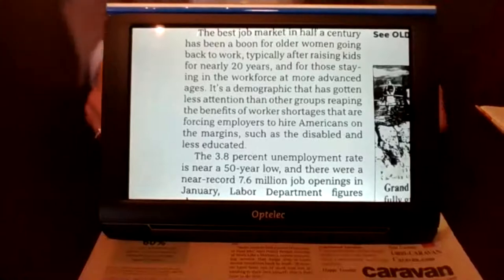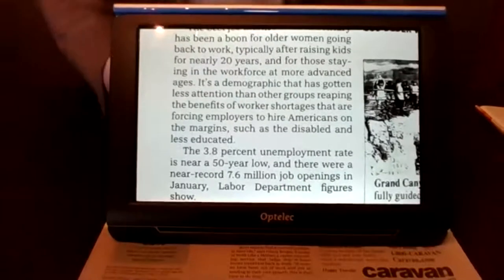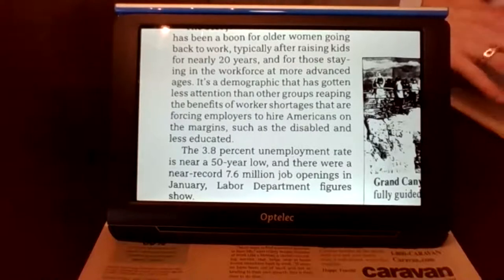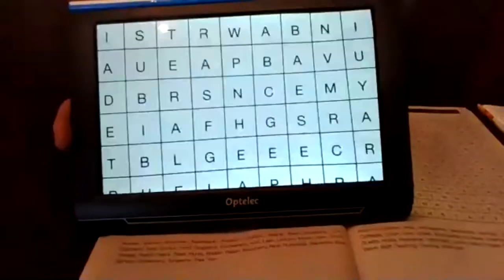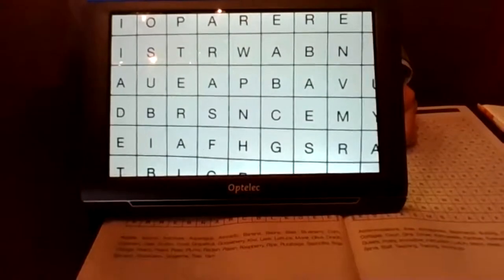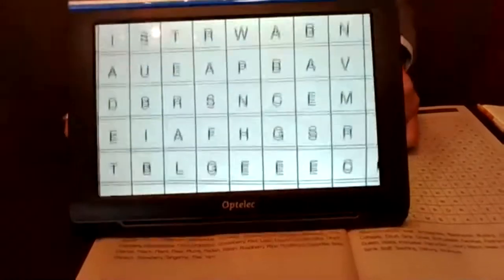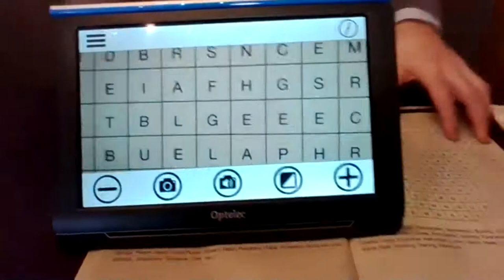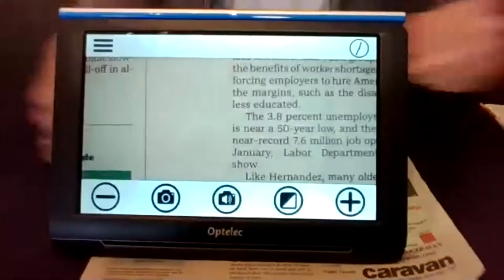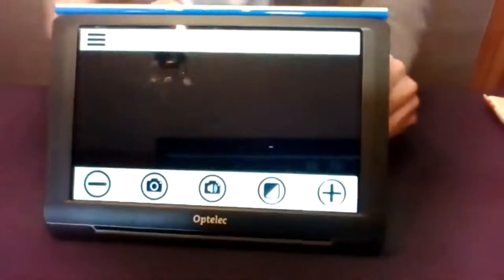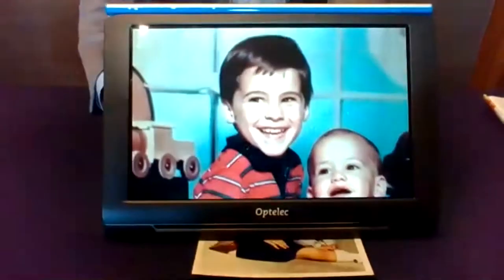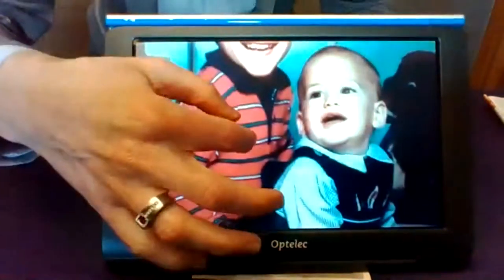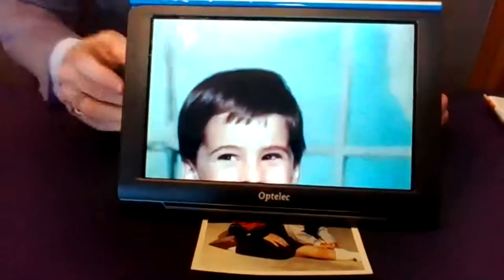This particular unit is a Compact 10 with speech, so in easy mode it still has the OCR component as an option. If you had the Compact 10 without speech, easy mode would simply be magnification up and down and contrast — no OCR button — another step to simplify the user interface. Here's a newspaper under the reading stand, and I can also put a word search under there. We can change all contrasts. If you want to look at pictures — I'll show you me with hair when I was just a young lad. The image quality is really, really great, and you can save a snapshot of a picture on the unit to look at later.